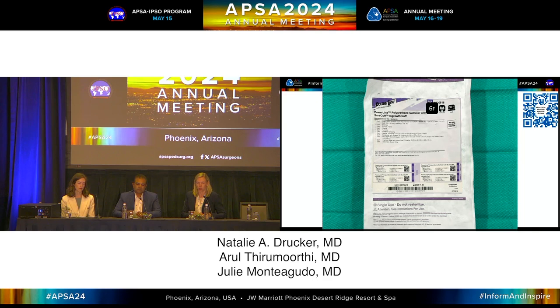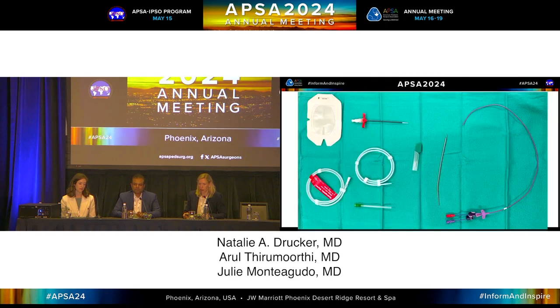They're power injectable. Don't be tricked, because the power line also comes in a non-power injectable form and it's very sneakily written on the packaging, so it's very important to get the one that can flow at 5 milliliters per second. That's the only thing you can do dialysis through. This is what comes in the kit.